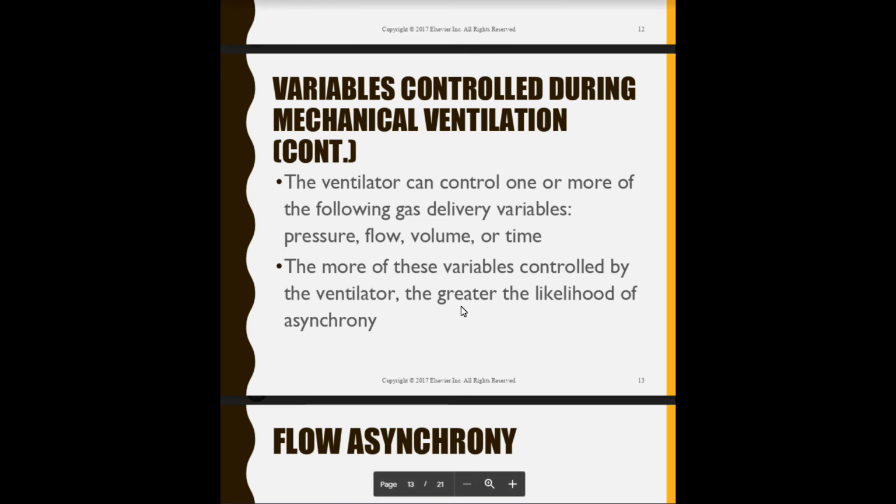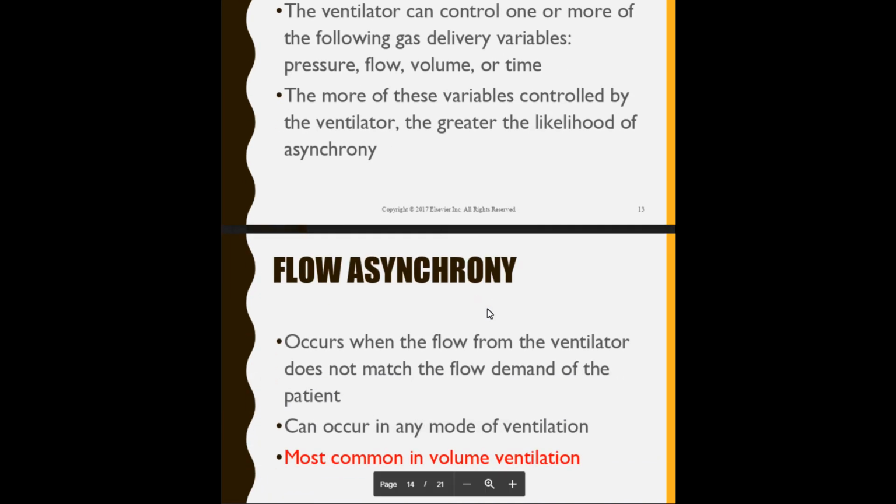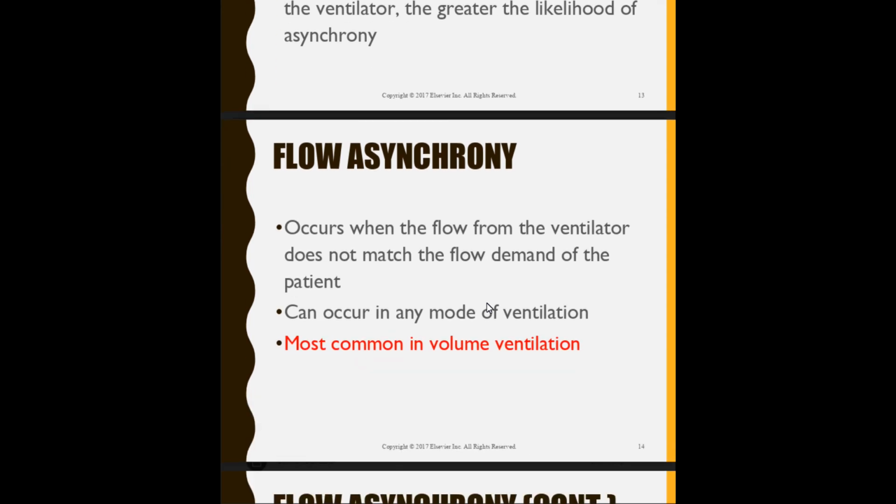Actually, it's the same way. We've seen that verbalized earlier in the slides. So again, we don't want to control so many variables, because it gives a greater chance to cause a ventilator asynchrony. Now let's talk about the different types.